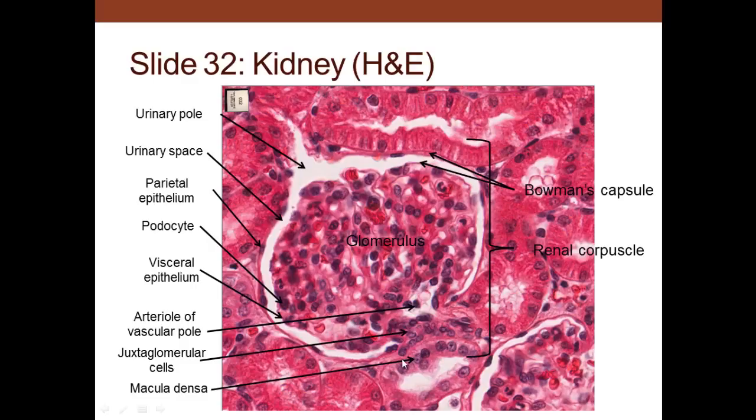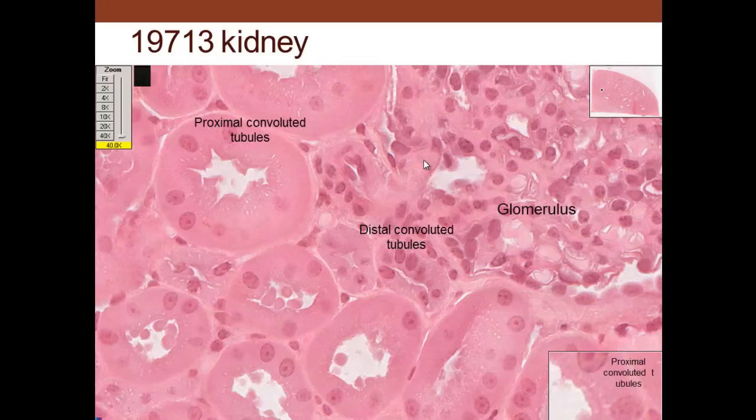and this is a distal tubule. These are proximal tubules, and here the more eosinophilic ones, less eosinophilic ones are the ones that are the proximal tubules. Another Bowman space in through there. So this whole thing is a renal corpuscle, Bowman spaces between these two. Here we see proximal tubules here and here, and this is a glomerulus in through there and a distal tubule.